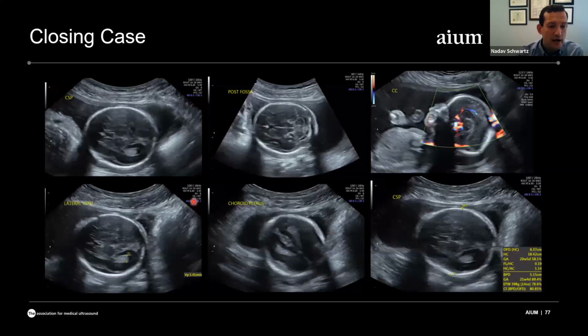So we have to look higher up, and so let's look into the brain to understand where this venous return is coming from. We went back retroactively, before we went into the room to do the diagnosis, to try to decipher what's going on. And these are the head views, and more or less seem appropriate.